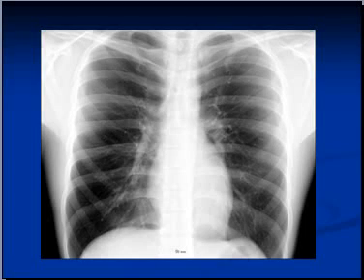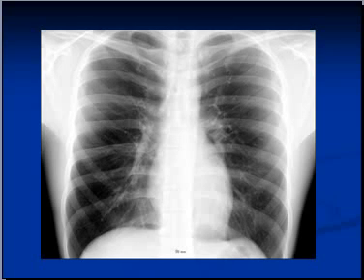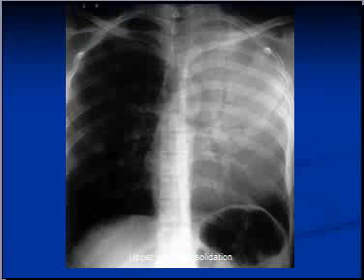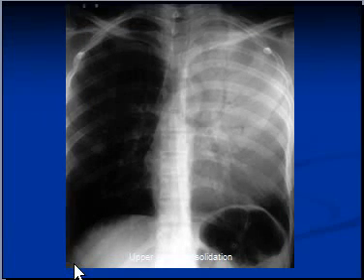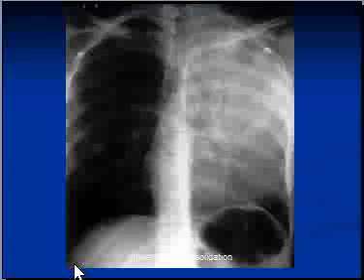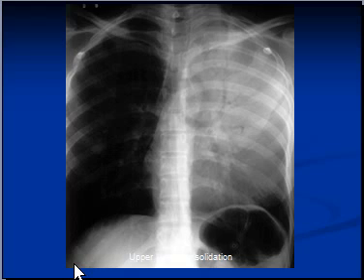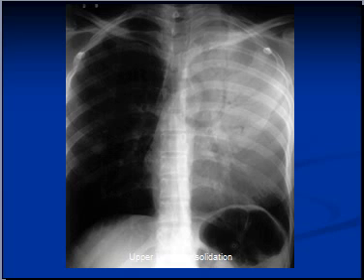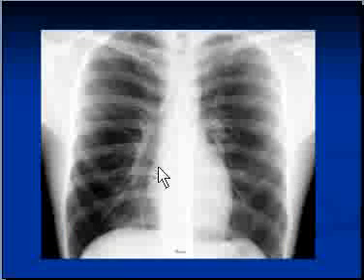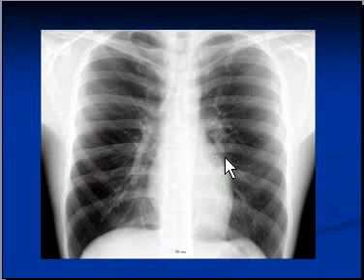The conditions that can produce a silhouette sign include consolidation, effusion, masses, and collapse of portions of the lung, known as atelectasis. One has to be very careful during interpretation, as the pathology has to be of decent size to produce a silhouette sign. The retrocardiac area on the left side can often be considered a false positive, due to either projection or normal variation in the steep slope of the left hemidiaphragm. A lateral view will often confirm or rule this out. The first X-ray clearly shows right and left heart borders.